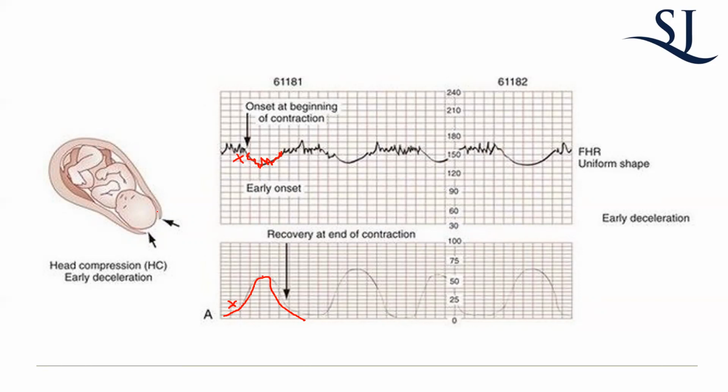And then once the pressure goes away, the heart rate goes back up. So when you see this, you're actually partially reassured, because you're saying, oh, maybe she's ready to deliver now because the head's low, especially when you see it with every contraction. Maybe she's fully dilated. But this still maintains in your categories 1, 2, and 3. This still rules in for a category 1 when you see it.